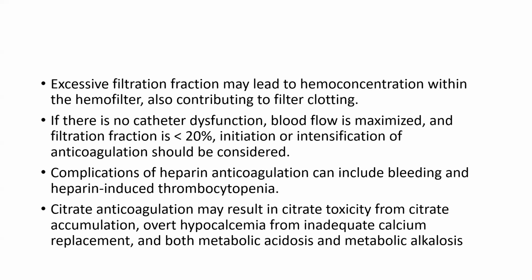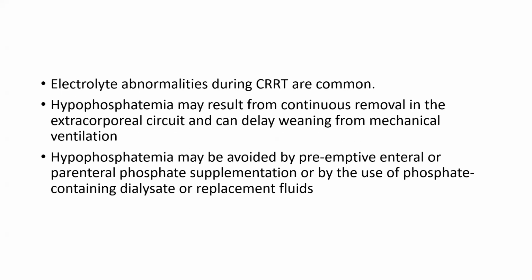If there is no catheter dysfunction, blood flow is maximized, and the filtration fraction is less than 20%, initiation or intensification of anticoagulation should be considered. Complications of heparin anticoagulation can include bleeding and heparin-induced thrombocytopenia. Citrate anticoagulation may result in citrate toxicity from citrate accumulation, and overt hypocalcemia from inadequate calcium replacement, as well as both metabolic acidosis and metabolic alkalosis. Electrolyte abnormalities during CRRT are common.